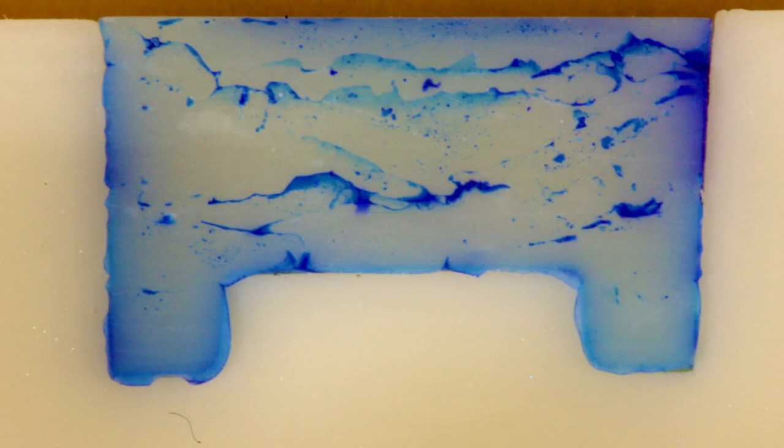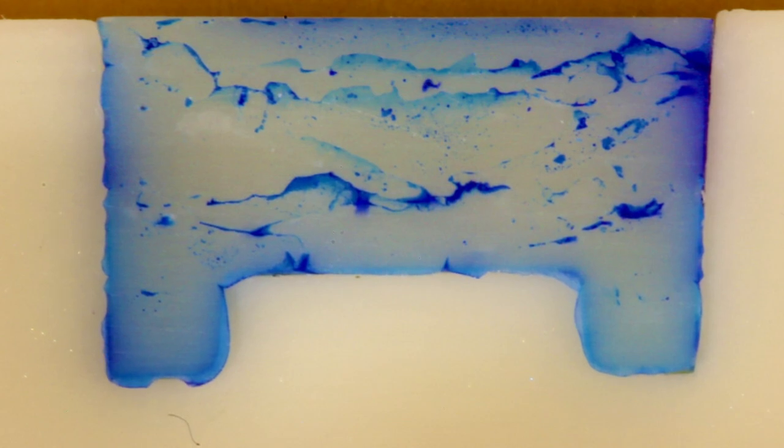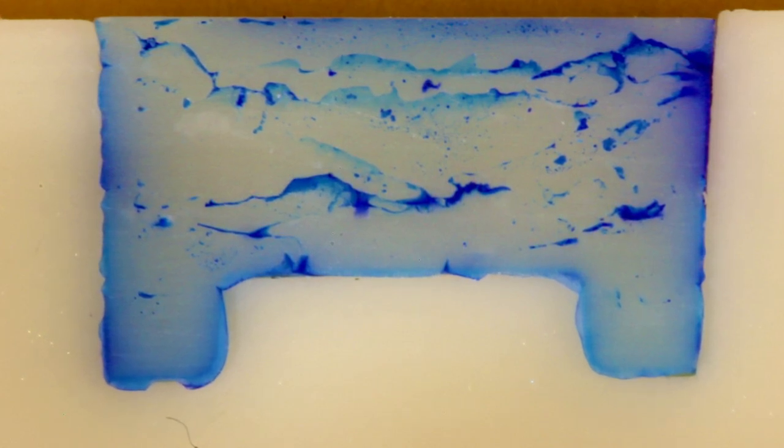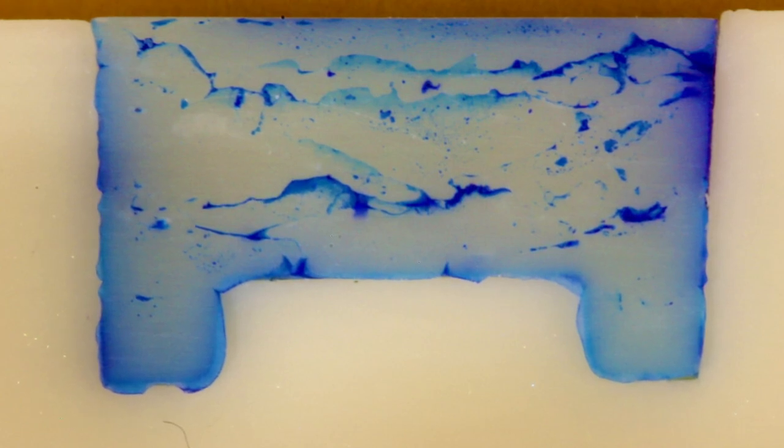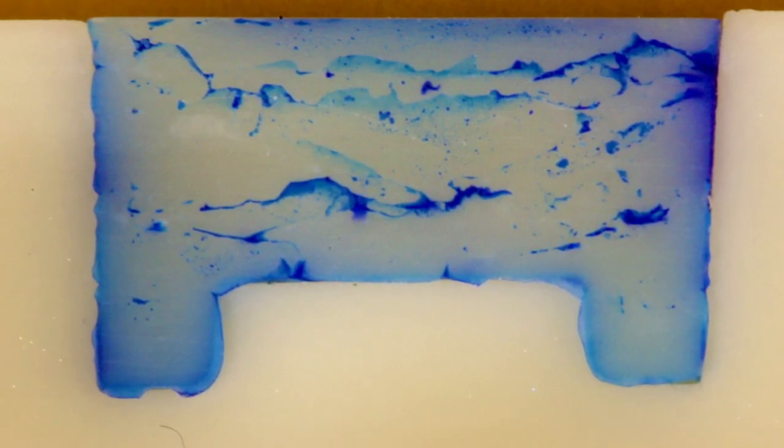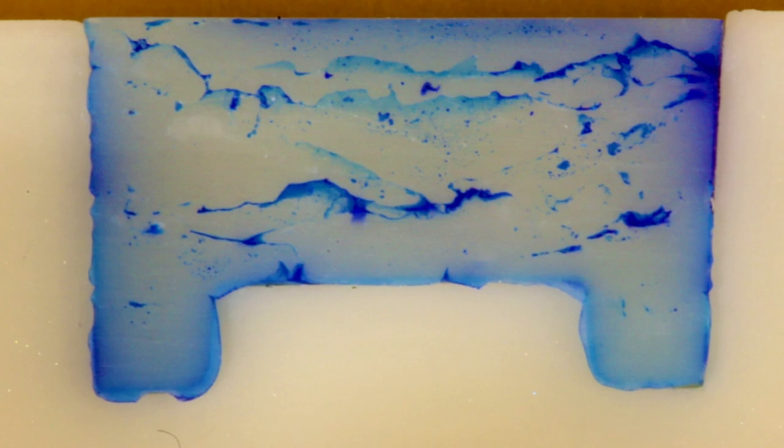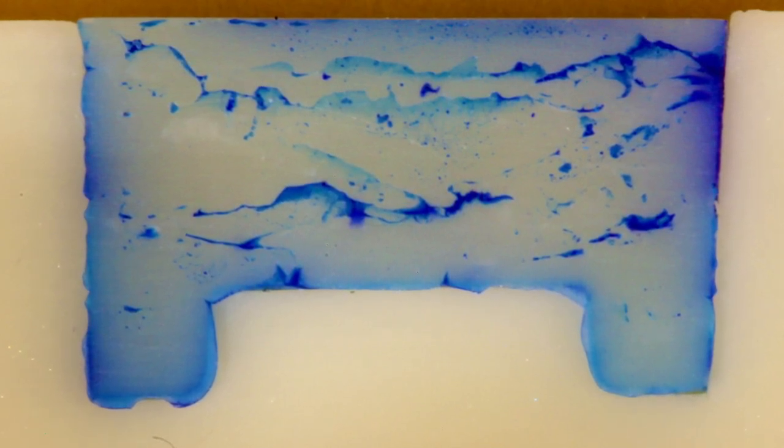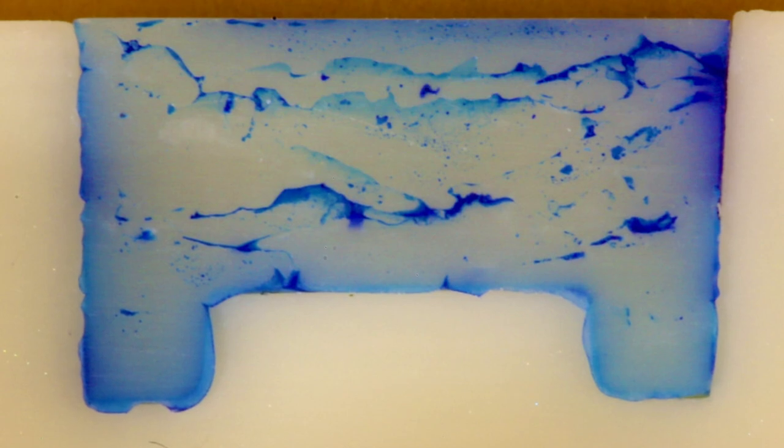When I open the mold and have a look at what I just produced, I can see the knit lines between each layer of composite. To make these lines more easily visible, I've placed blue stain on the surface of the composite and now you can clearly see the join between each increment of composite.